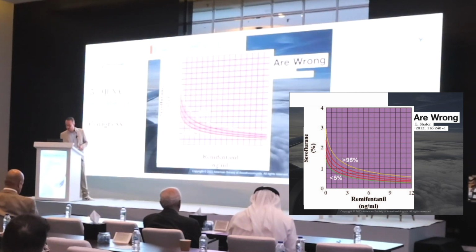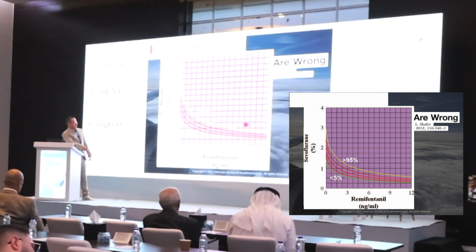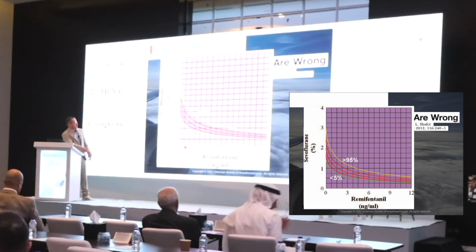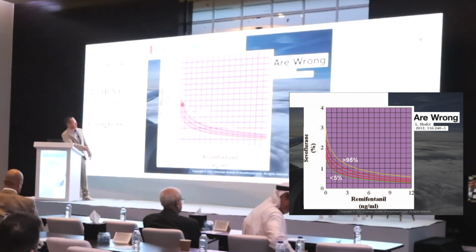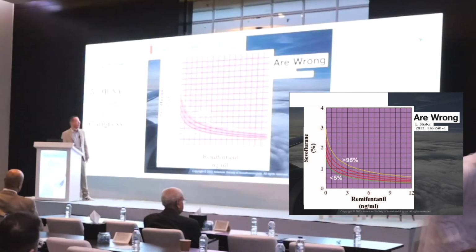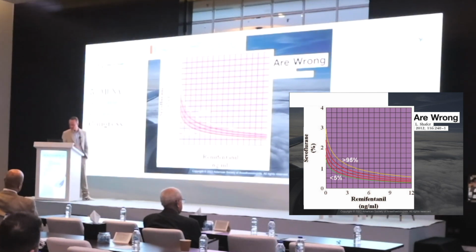So you can have the clinical effect with a high opioid concentration, like, for example, 9 nanograms per milliliter remifentanil and less than 1% end-tidal sevoflurane, or you can have the same clinical effect with almost no remifentanil and 2% of sevoflurane.